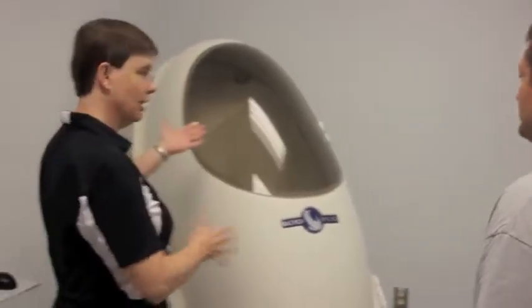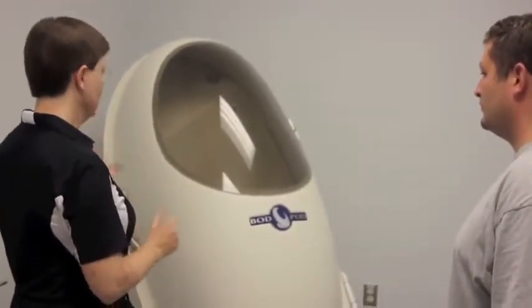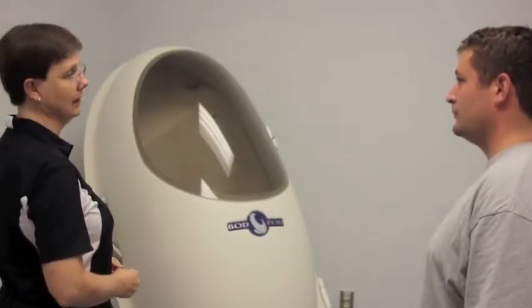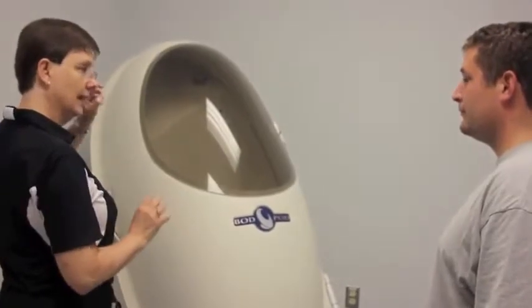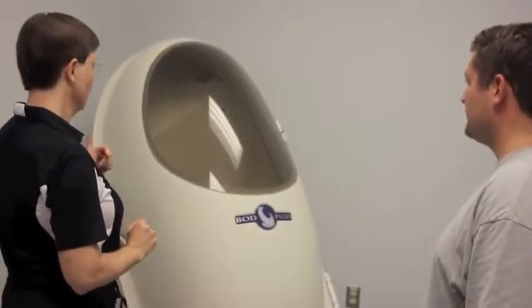This is the back chamber and the front chamber exchanging air to balance each other. When you're in it, it will pump back and forth and it sounds like a puppy panting. And those are the magnets that click shut so we get a good seal around the edge for an accurate test.